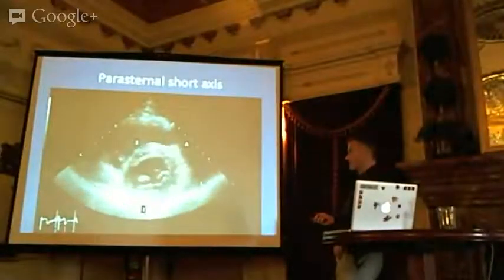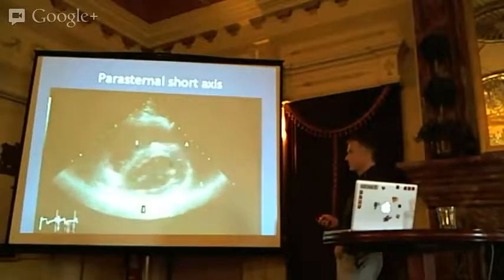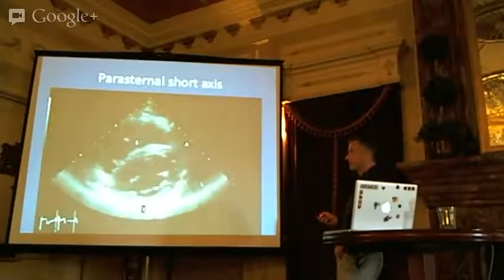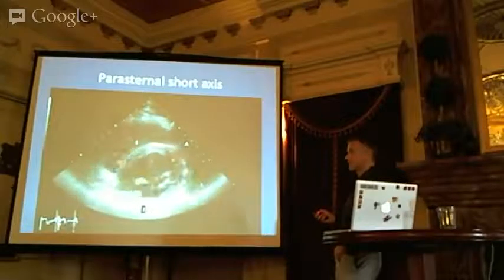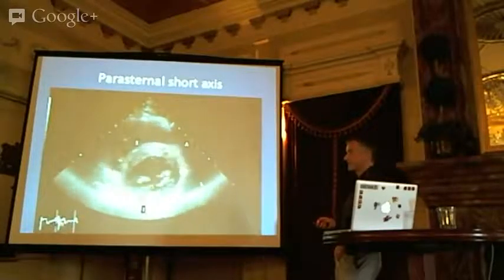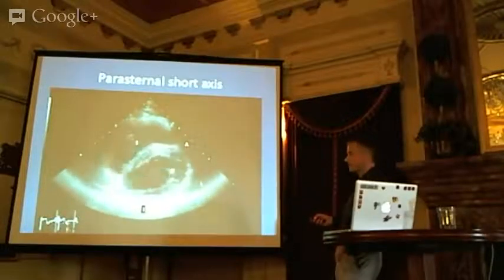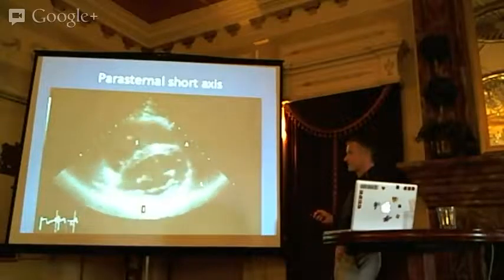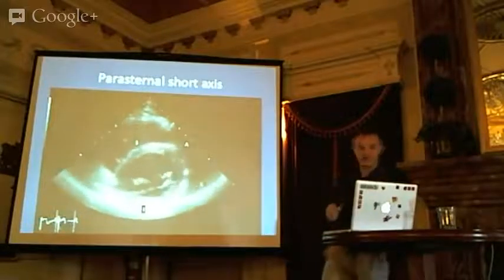So here's a parasternal short axis view. You've got the left ventricle contracting fairly evenly all the way around. You've got the right ventricle and the capital D wrapped around the outside. And I ask myself the same questions. Is there fluid around the heart? Is the right ventricle bigger than the left ventricle, pushing on the septum? Is the left ventricle contracting evenly all the way around? And is the chamber size getting smaller in systole? At this particular level, that's the mitral valve opening and closing. Things I have to see are just reminders: that's the septum, the anterior wall, the lateral wall, the inferior wall. You might see a regional wall motion abnormality.